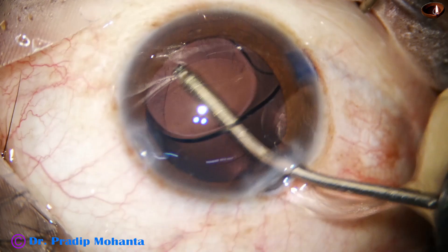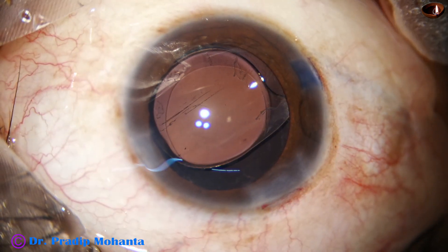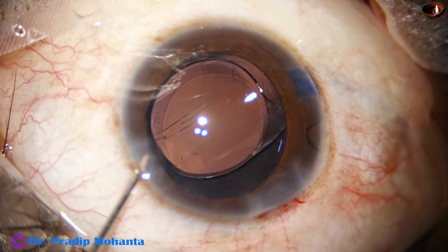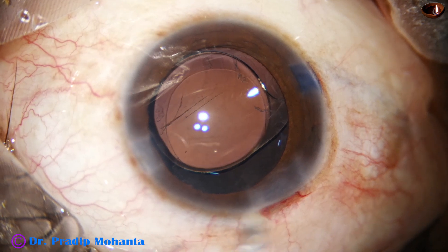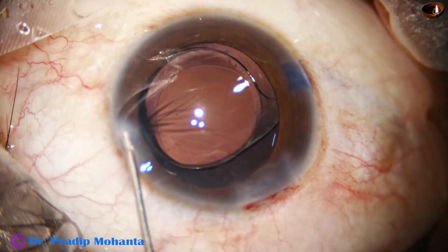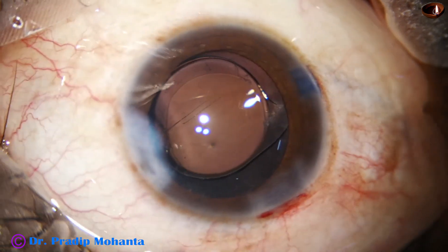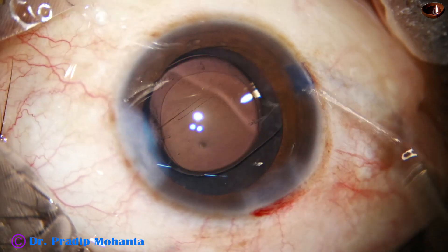Some polishing of the posterior surface of the lens is being done — something is sticking to the posterior surface of the lens. Now the side ports are closed by corneal stromal hydration.